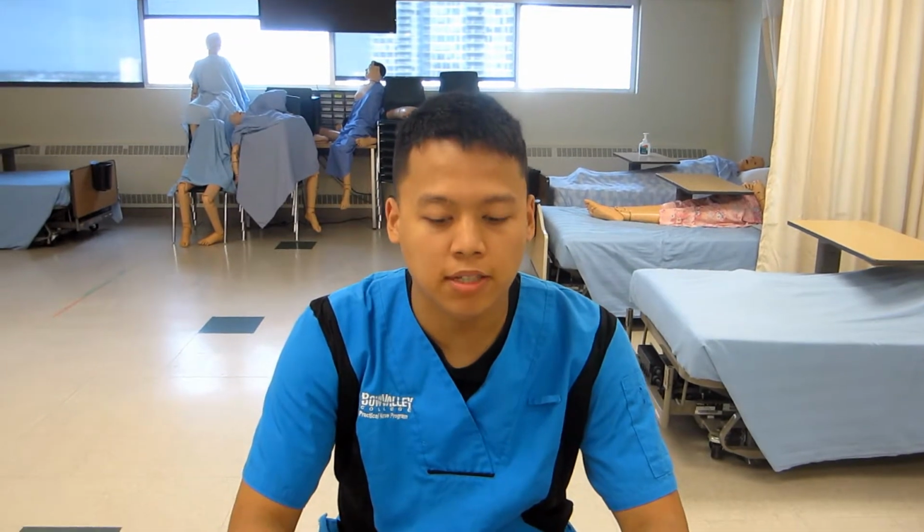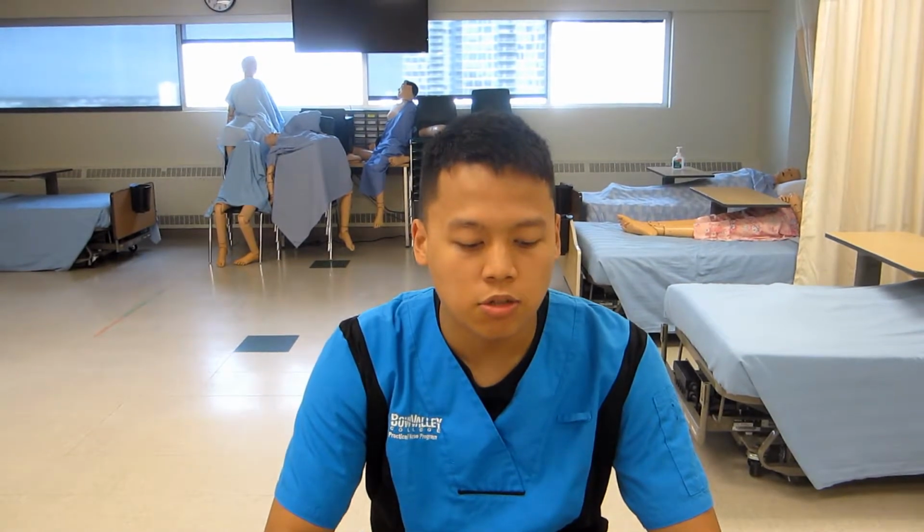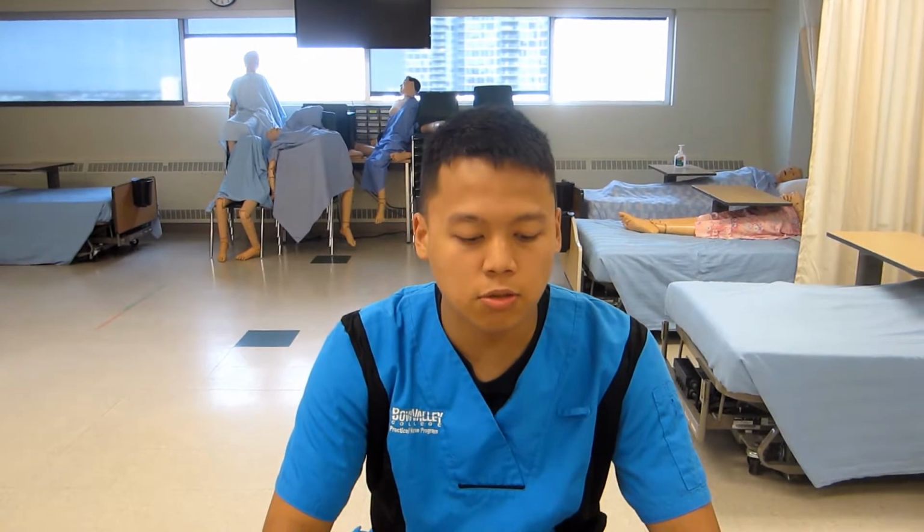Transferring patient from bed to stretcher. Hand hygiene, introduce yourself and explain the procedure to patient and reason of procedure. Verify the patient. One nurse assume the leader role. Use a friction reducing device under the patient like a draw sheet. Nurses need to be on the opposite side of the bed holding the draw sheet.